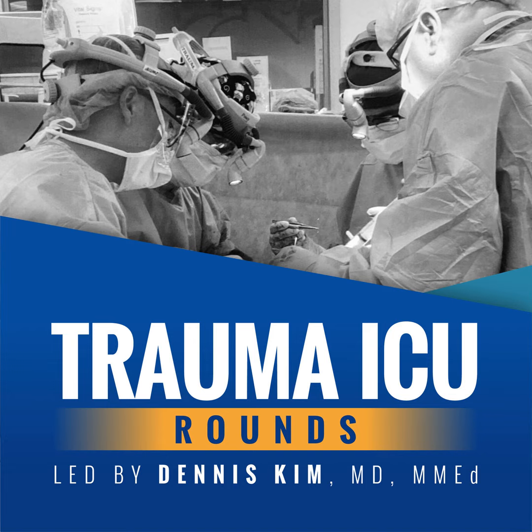But it really is a fine balance because we want our patients to work, but we don't want them to work too much, which is why we oftentimes supplement spontaneous breaths with some level of pressure support. And by definition, then these would actually be assisted breaths.